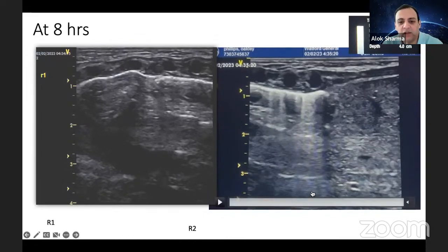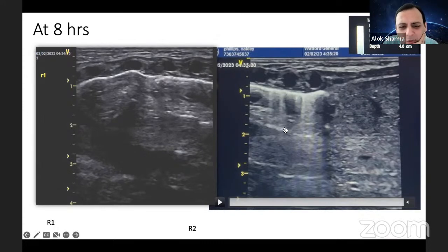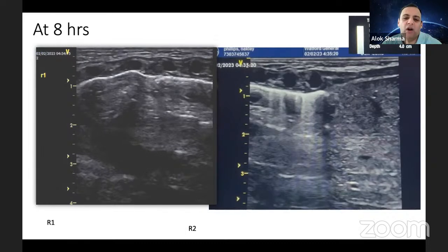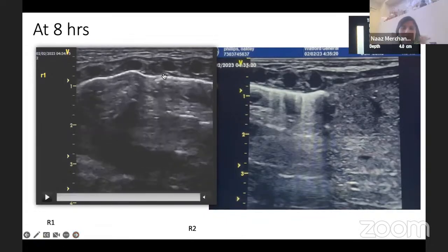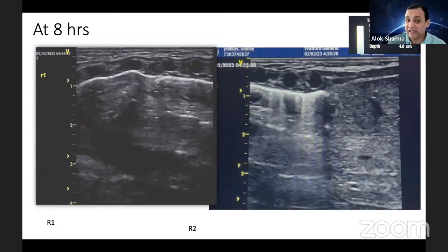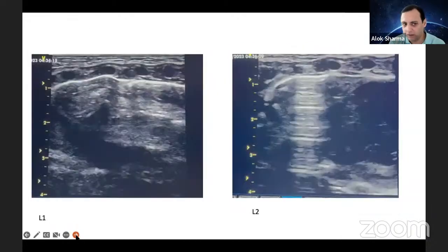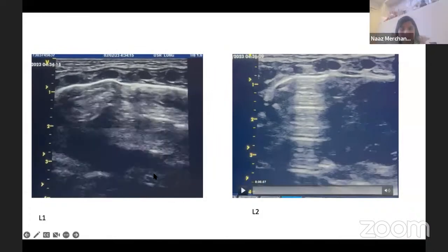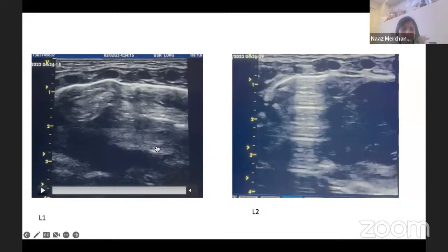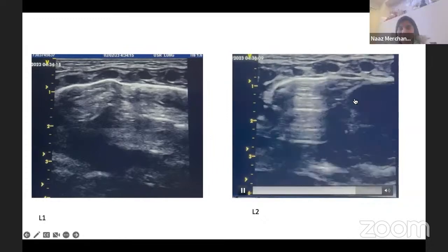The images are beautiful. That break in the pleura — my gut feeling is it's just a little artifact where the pleura overlaps on itself during sliding. The perpendicular nature of your images is beautiful as demonstrated by the ribs. On L1 — lovely pleural sliding with lots of A-lines, more of an A-profile. On L2 the heart kept coming in the way. The best way to handle that is when the probe is held longitudinally, start from the medial end of the midpoint of the sternum — the heart is there, so when you bring the probe in the heart comes into view. You'll need to go higher up at R1 and slide across to get the heart out of the way.